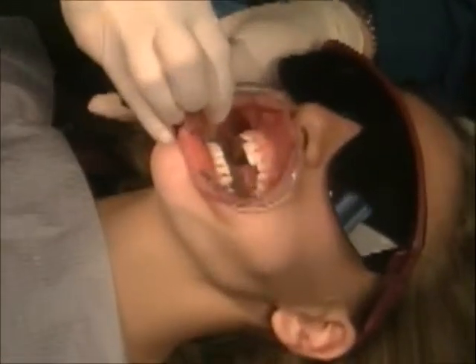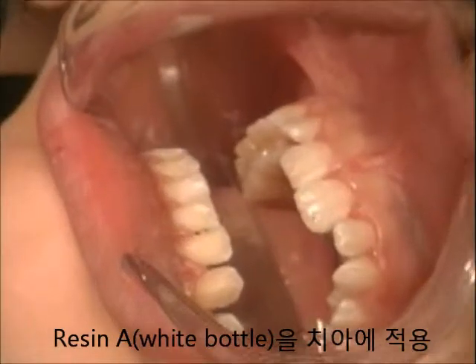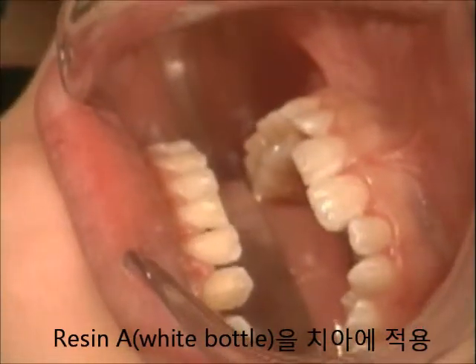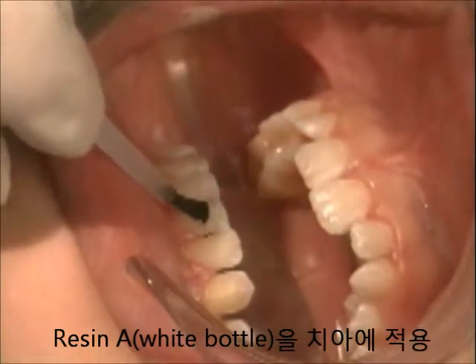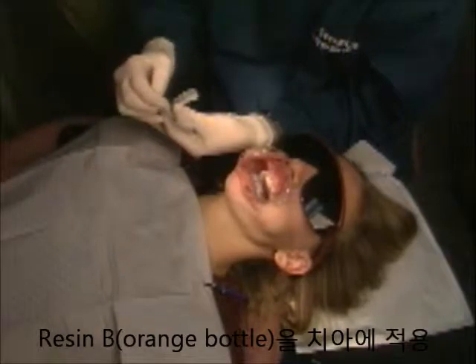Paint a thin layer of resin A onto the teeth. Applying this thin layer is similar to painting one's nails. Note how the thin layer of resin A is applied to the tooth surface, and how the thin layer of resin B is applied to the custom resin base.